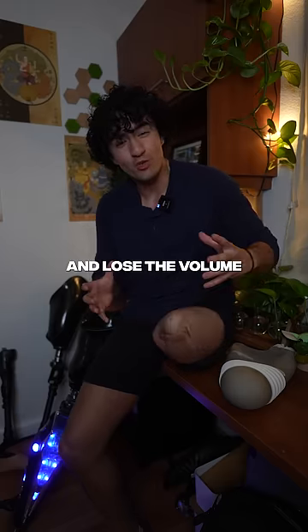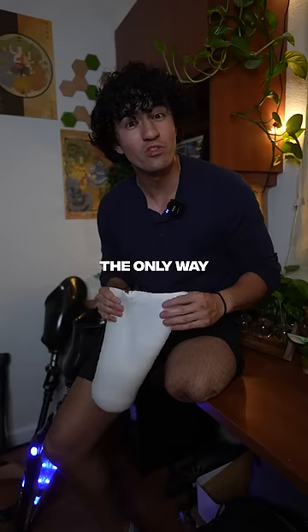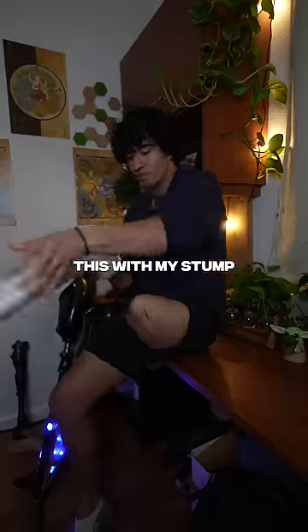Right now my stump is starting to shrink and lose its volume. This socket is made to a specific weight that I have. The way to keep my prosthetic on is with this liner, which I put on my stump.